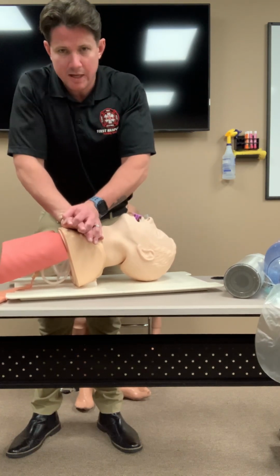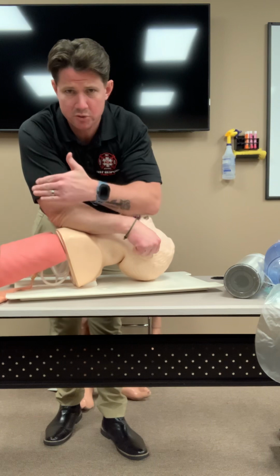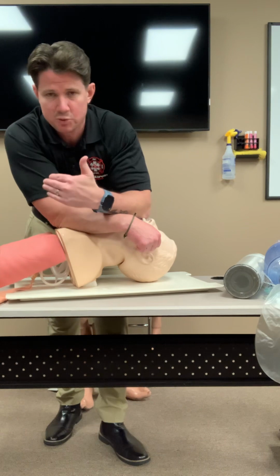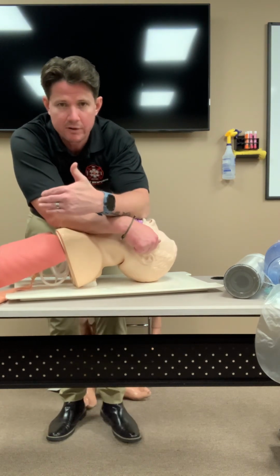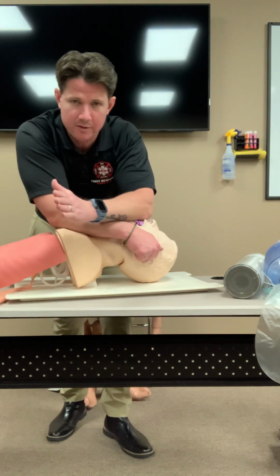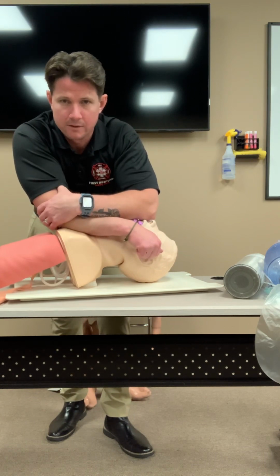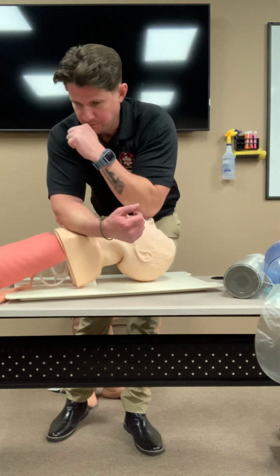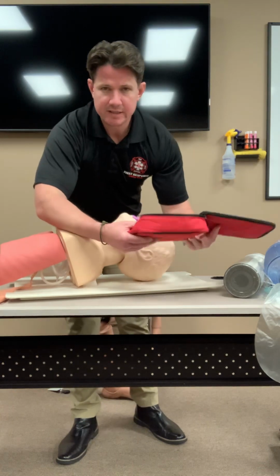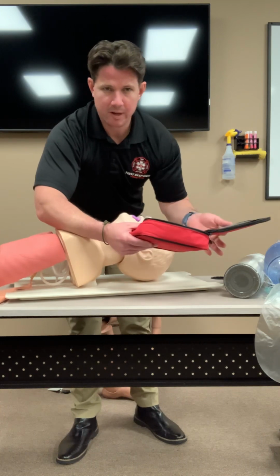I'm gonna do this for 5 cycles. I'm trying to achieve 100 to 120 compressions in a minute. I'm going to compress the chest at minimum of 2 to 2.5 inches, or 1/3 the depth of the chest. In between each compression, I'm gonna ensure that I'm allowing for complete chest recoil and the ventricles to fill up. So when I compress again, there's plenty of blood to be circulated throughout the body. All right. Now, once you tell me everything you know about CPR and you perform a cycle of CPR, your AED is going to arrive, right? So while you are continuing CPR, you're gonna open up the AED, right?